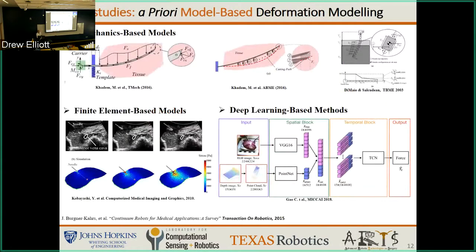To address this, as you see, there is abundant literature. You can check model-based approaches, like needle insertion, which is a deformable instrument inserted into a deformable object. So here you have two deformable objects, I call it. When I say object, it can be a tissue, it can be a robot. You can see approaches from model-based, to finite element analysis, to machine learning. We can find a lot in the literature.